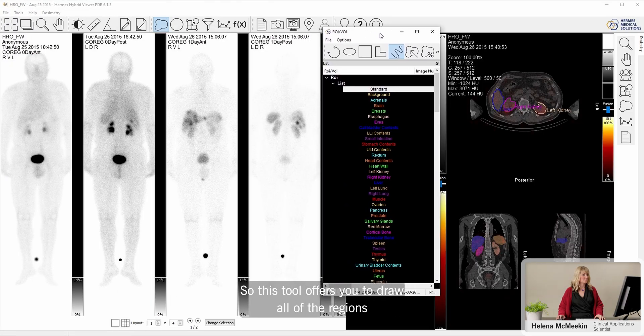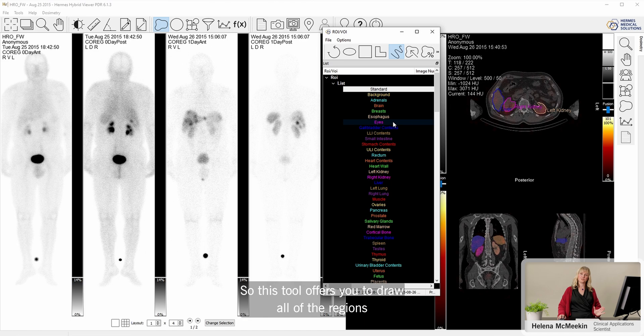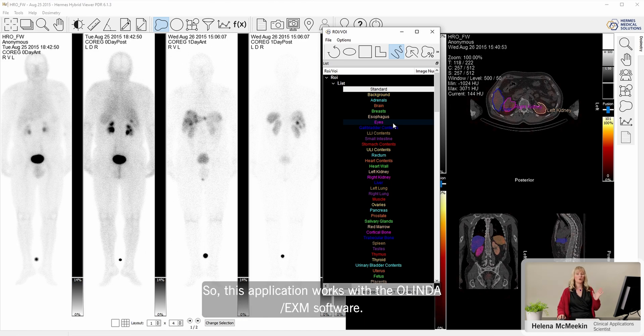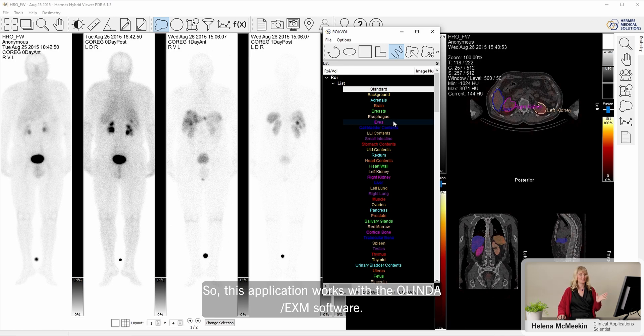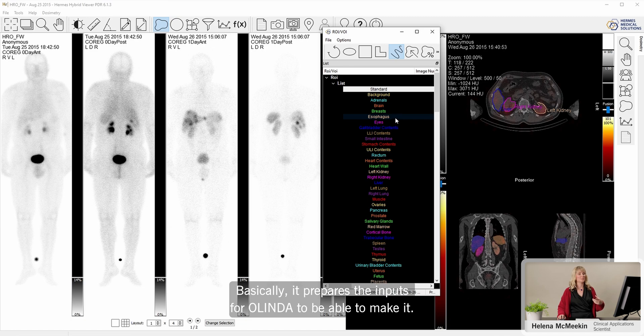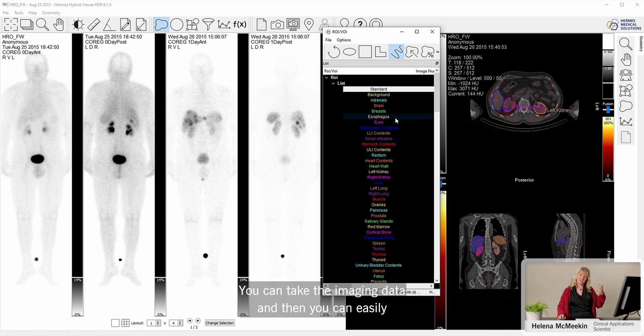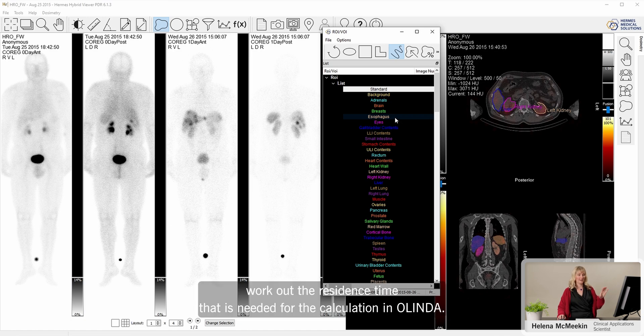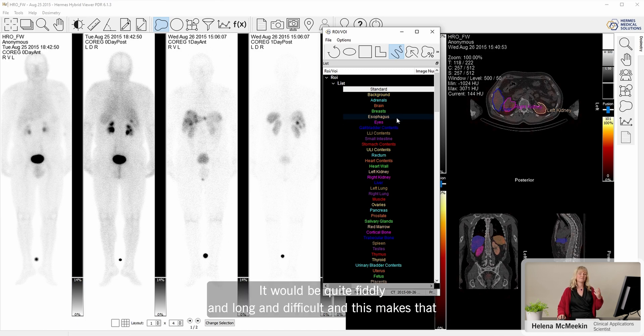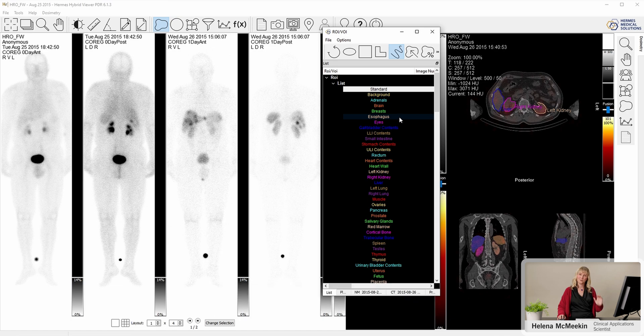This tool offers you to draw all of the regions that are possible to draw for the Olinda models. So this application works with the Olinda EXM software. Basically, it prepares the inputs for Olinda. You can take the imaging data, and then you can easily work out the residence time that is needed for the calculation in Olinda. Normally, that would be a spreadsheet calculation, and it would be quite fiddly and long and difficult, and this makes that all much easier.